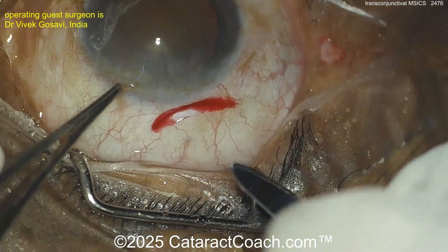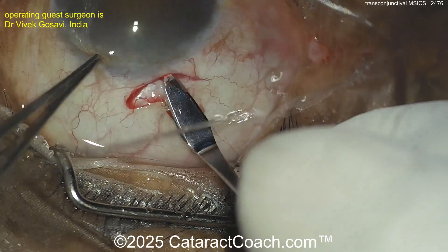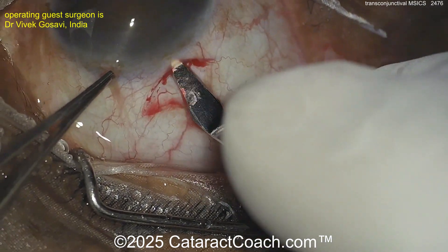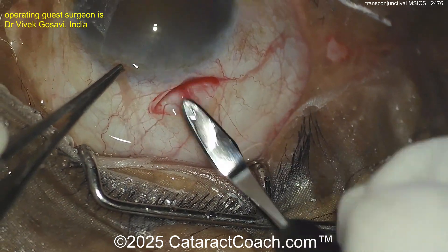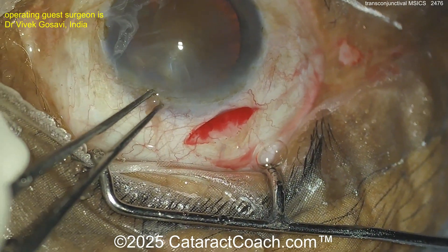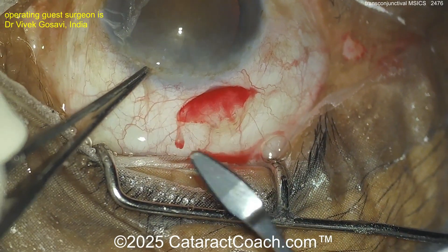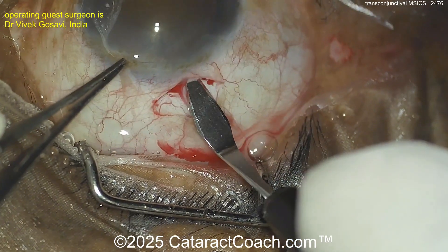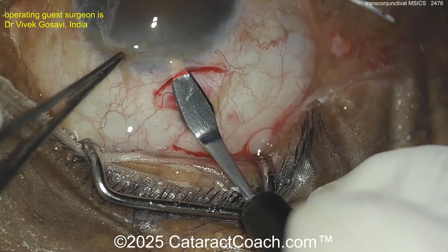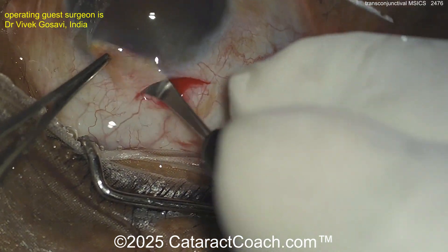Not pulling back the conjunctiva, not doing a special peritomy — now going with the crescent blade to create the incision. That looks very interesting to me. I've always done an MSICS incision, or any scleral tunnel, in two layers: I pull the conjunctiva back, do a peritomy, expose the sclera, then make the scleral incision. My thinking is that doing it in two layers gives an extra barrier to prevent infection or other problems.